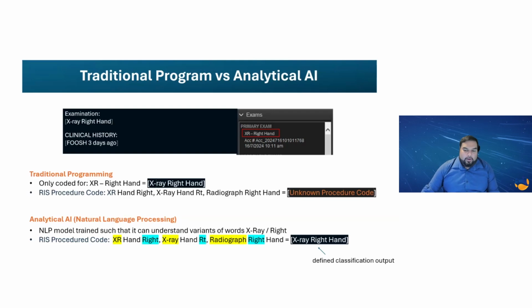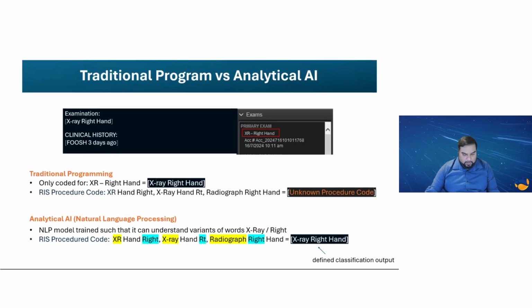The important thing to note here is that the classification list, in this particular case would be every possible examination header, has to be predefined.